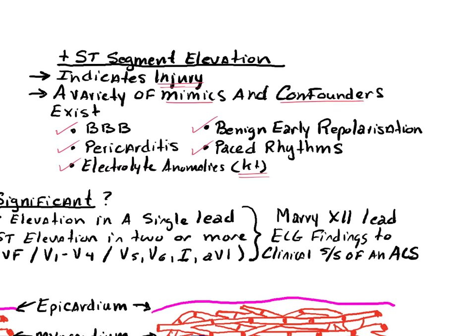If you're pacing somebody or somebody has a pacemaker and you have capture, if you have some ventricular component to the pacing, those QRS complexes are almost always going to be what? Well, what are they going to look like? Paced rhythms, what do they look like? Pacer spikes, and what does the QRS complex look like, though? Wider. It's a wide, bizarre-looking complex, right? Because if you capture in the ventricles, that's a ventricular pacemaker, and you're going to get those wide, bizarre complexes.